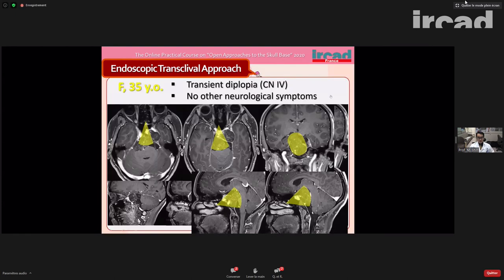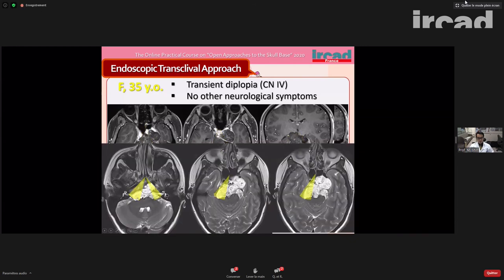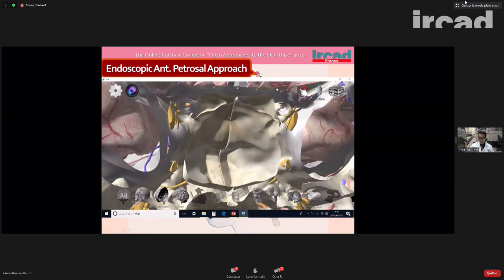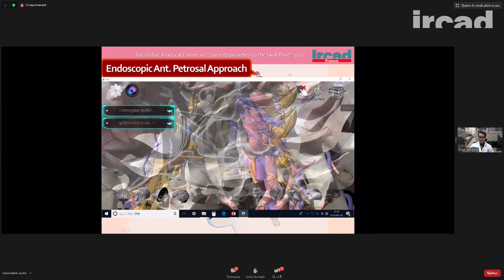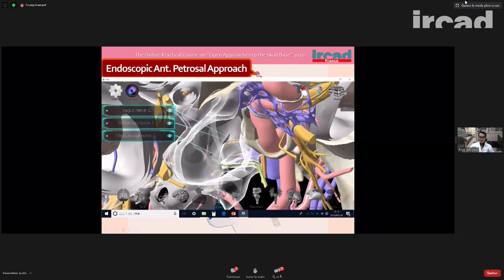So when we consider how to treat the lateral part here, the petroclival region, where there is a tumor very close to the internal auditory canal, I think we recommend the endoscopic anterior petrosal approach. So again, we see it on the software. There is an internal carotid artery on the lateral side of the sphenoid sinus. And there is a small space behind the internal carotid artery here. There is a lower cranial nerve here, and far from here, there is a facial nerve and acoustic nerve.